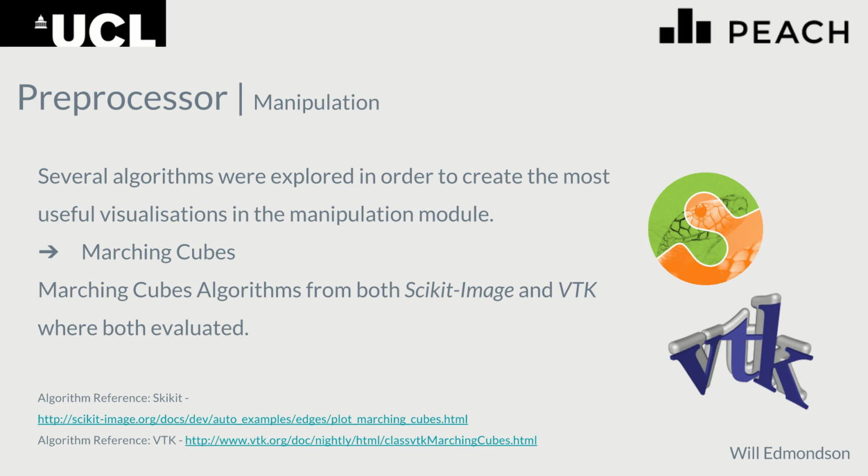We look into the scikit image and the VTK implementations, and these are both evaluated in the testing section.